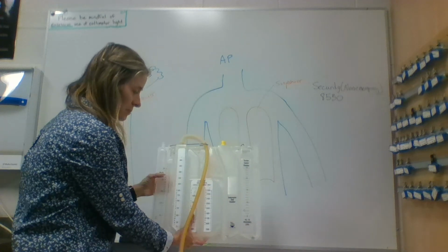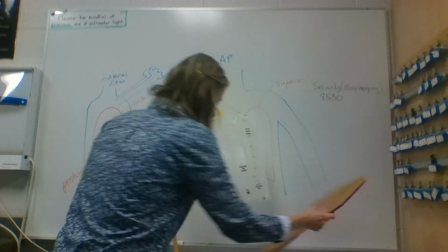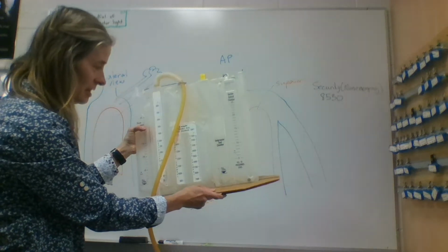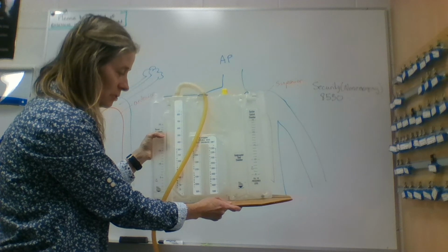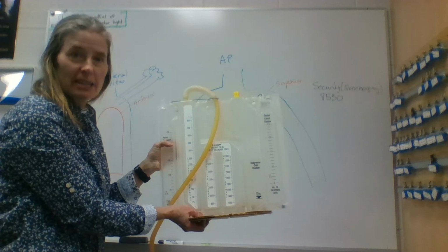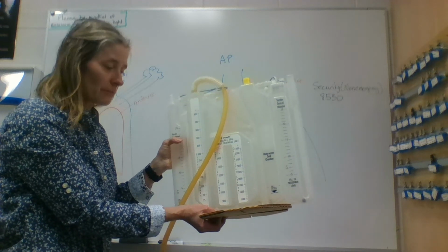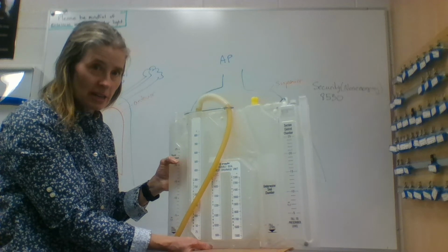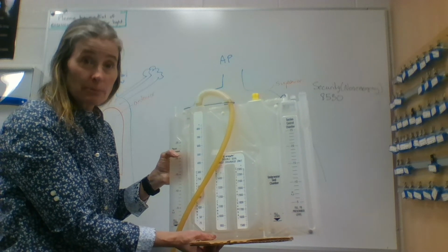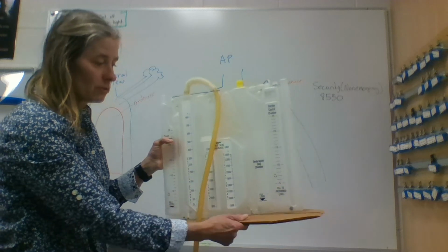Now, the drainage unit does have these little feet. In this case, this one's not the highest tech, but they have these feet underneath here, and often they'll be a blue color. They're just a slide mechanism. You can slide it, and that provides a base of support. So the chest tube can be placed safely and properly on the floor by the X-ray table or the CT table, just by using these feet.